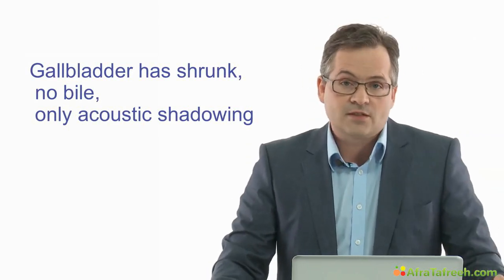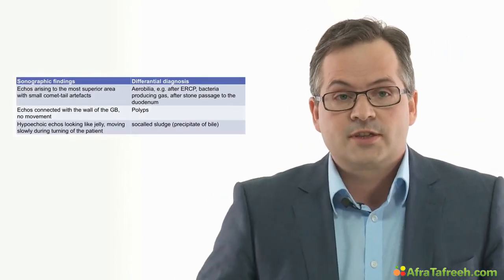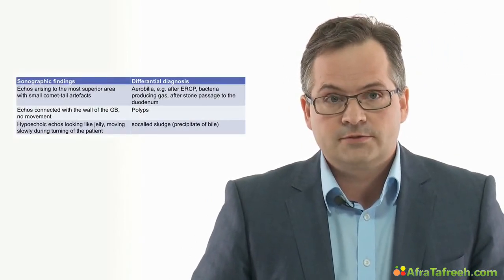So the key message is, it's very easy to miss gallstones if there is no more bile in the gallbladder. We have to look for acoustic shadowing to find the organ and make the diagnosis. But we have to keep in mind, not every echo in the gallbladder means that there is a stone. Here too, it's essential to know the differential diagnosis for echoes in the gallbladder.